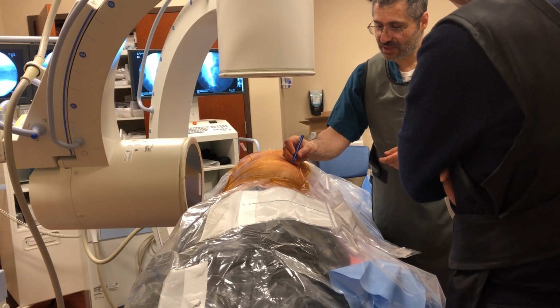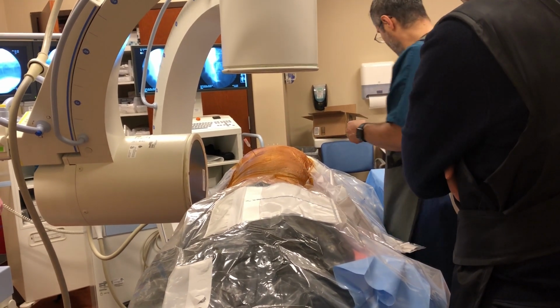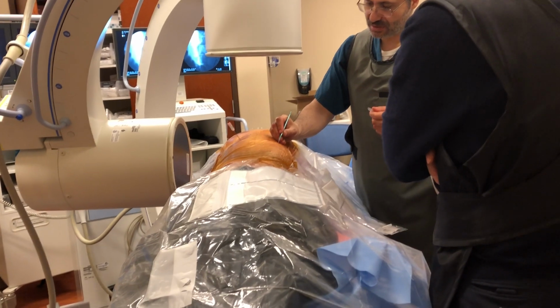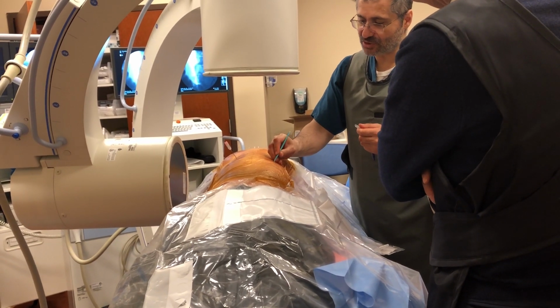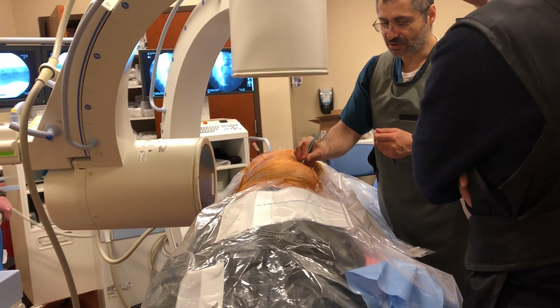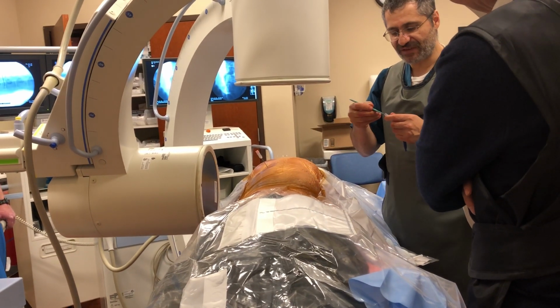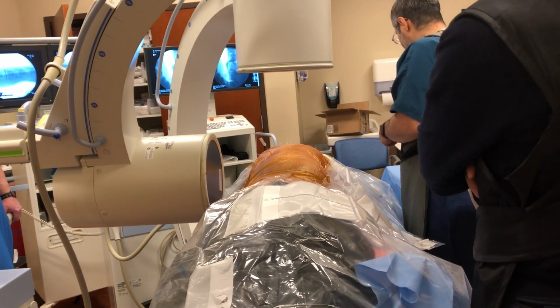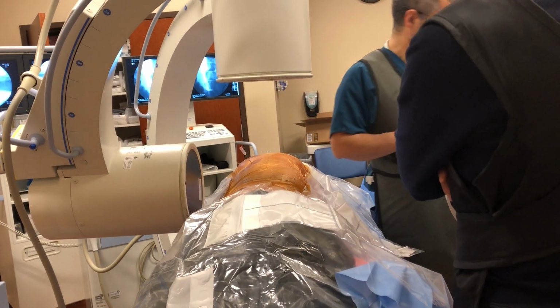So now here, obviously at this point, we make the incision. The incision doesn't need to be bigger than what the cage needs to go in. So half an inch is more than enough. And the next step is, where is that probe? Where, guys?